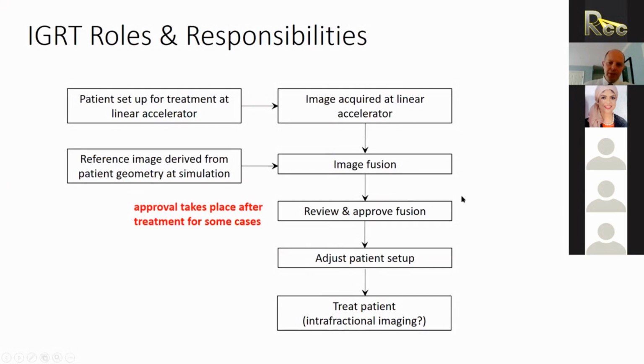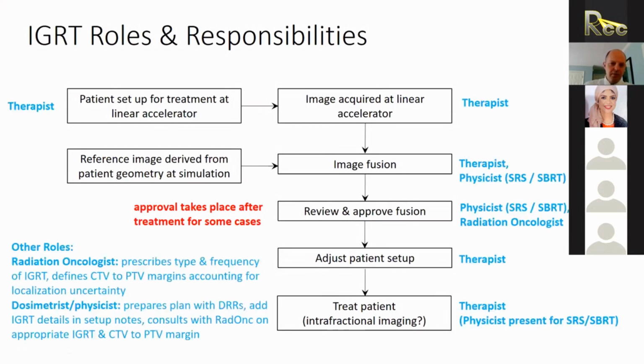So, the one thing to note is this approval, the review and approval, in some cases occurs before the treatment, and sometimes it occurs after the treatment, and that may just depend on the type of case and the protocol and how things are done in each specific clinic. And so where each professional or specialist falls in here, I've kind of marked out.